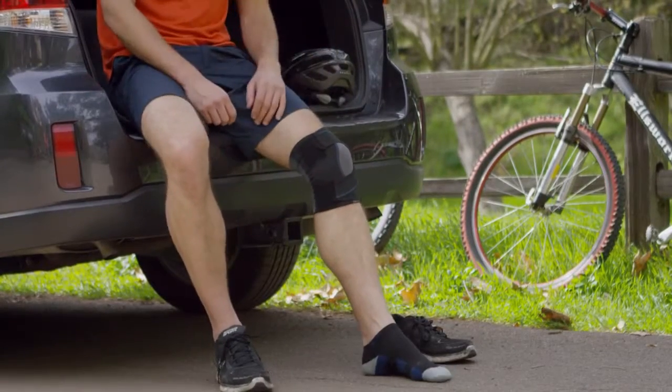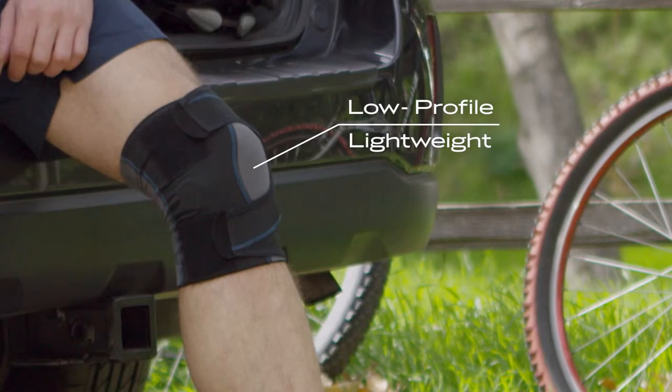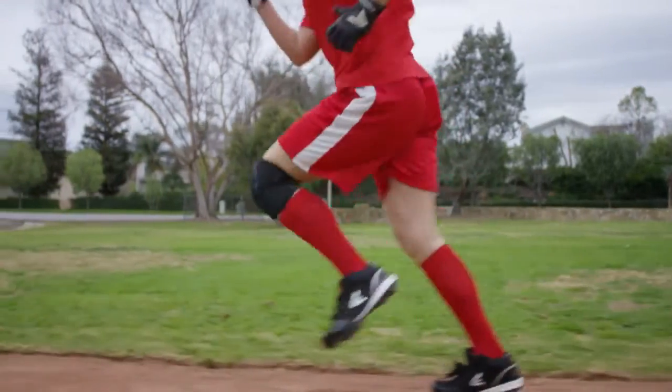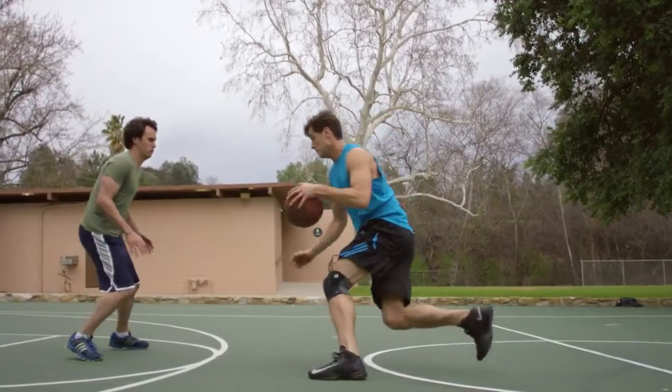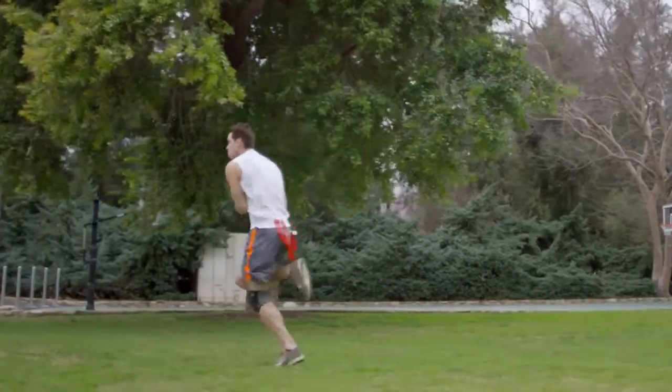The first thing you'll notice about the brace is the ultra lightweight, low profile — just eight inches tall and weighing only seven ounces. The FreeSport was designed to offer minimal interference in your daily activities, so you can continue to focus on your game and not your brace.